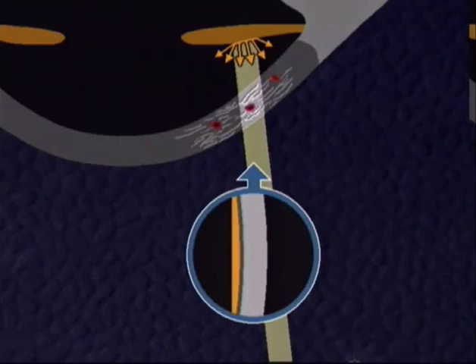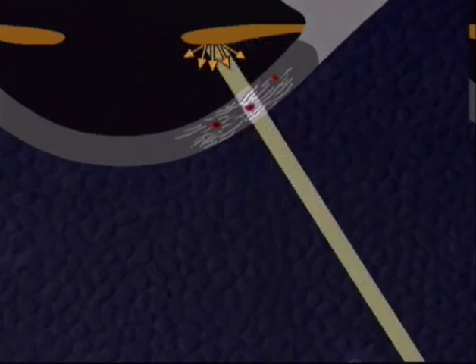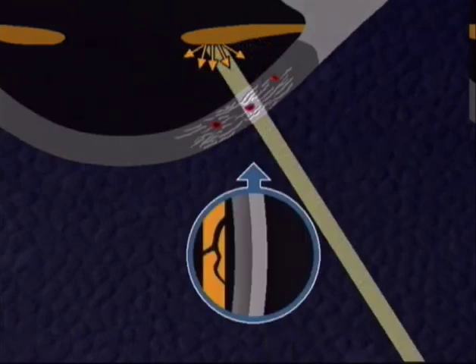To eliminate the overlap of the two illumination modes, these can be separated by increasing the illumination angle. Then, in the microscope view, scatter and backlight are seen separately because the gray scatter has moved to one side and the brown backlight to the other.